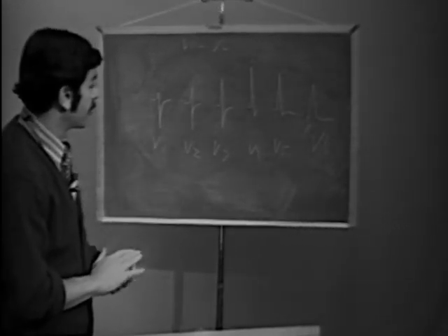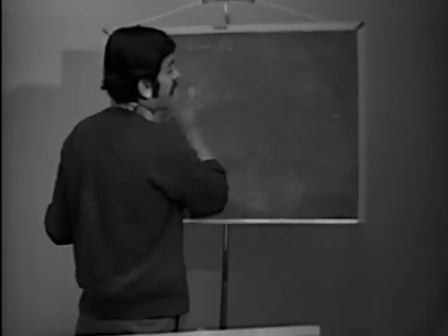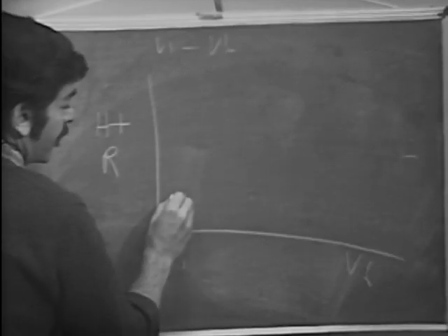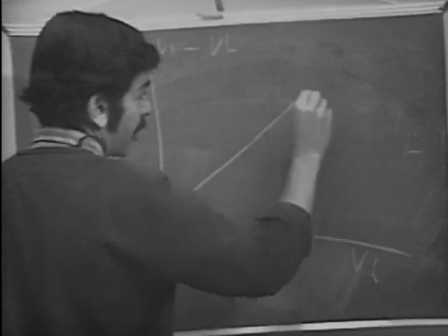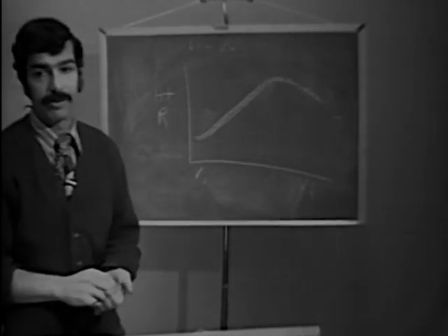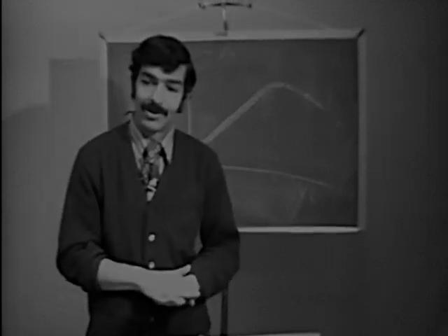So in every tracing, we're going to be looking at normal R wave progression. We'll be using this diagram later on. If we make a plot, this is V1, this is V6, and this is height of the R. In V1 it's about this tall, and then it's gradually getting bigger till around V4, and then it's gradually decreasing again. So this would be a plot of what I've just drawn for the normal R wave progression. Any questions then about normal R wave progression?